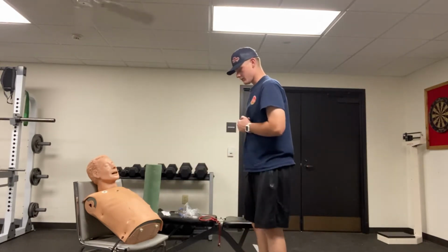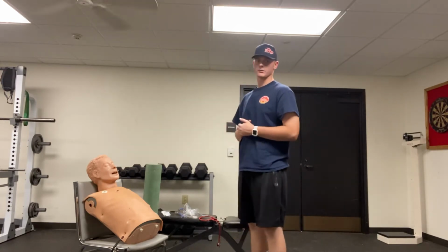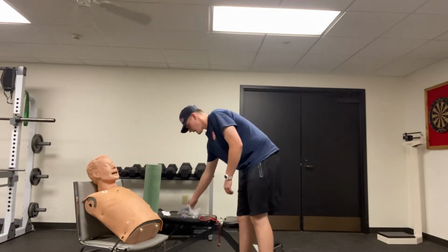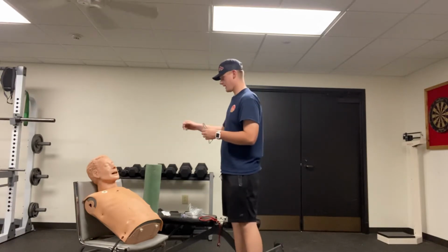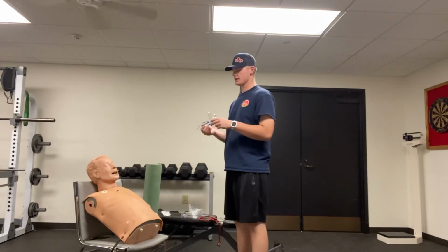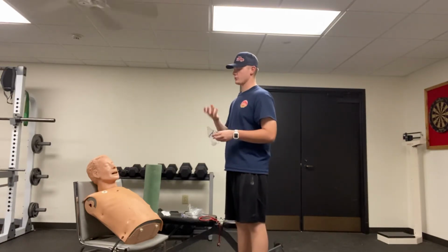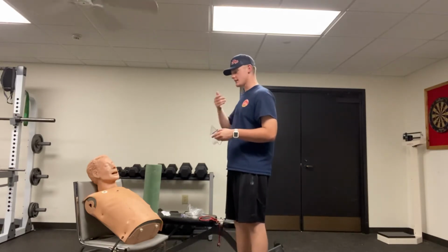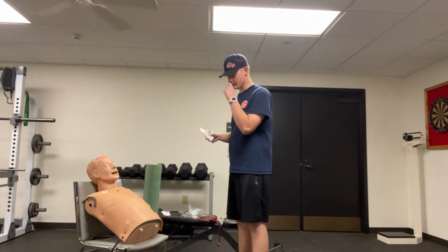I am going to then tell the patient what I'm going to do. So, sir, ma'am, I'm going to have this mask right here filled up with medication. I'm going to connect that to this oxygen bottle. I'm going to place this over your head, placing it on your face, and you're just going to breathe and inhale, and I'll coach you through the process. Whenever I say to inhale, inhale, and whenever I say to exhale, you can do so as well.